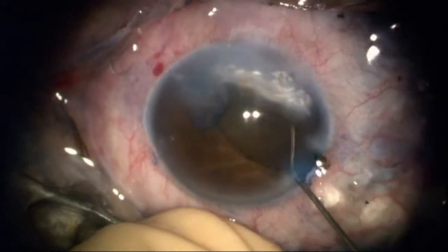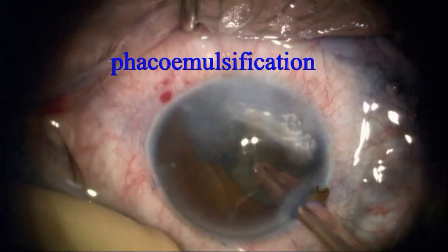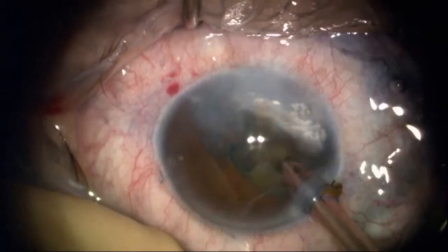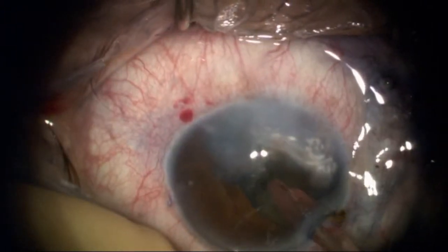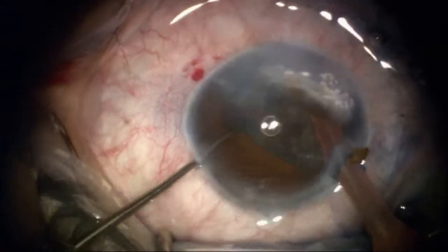I'll follow this with a very brief but brisk hydrodissection — very brief because I don't want any more iris prolapse than I'm already dealing with. There's a lot of atrophic iris here and I'm trying not to make that worse, so I'm going to use a low flow state.